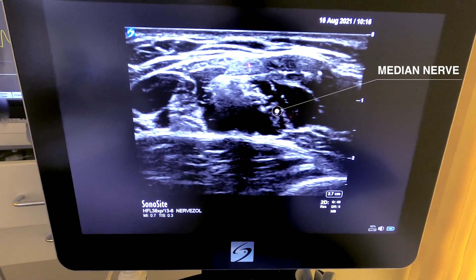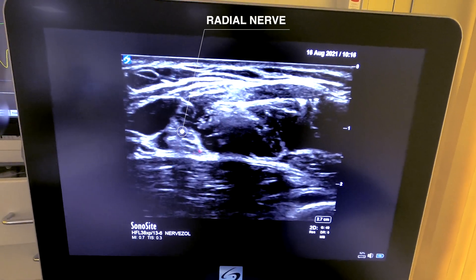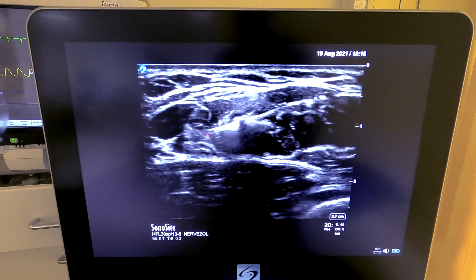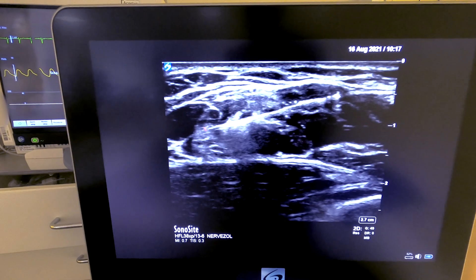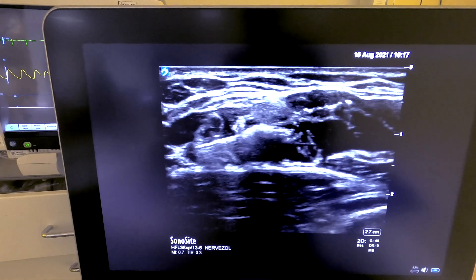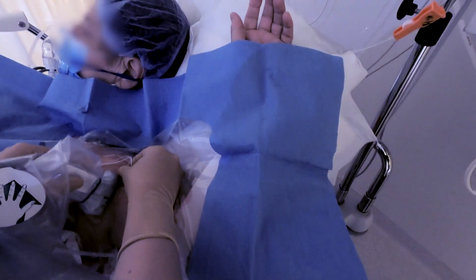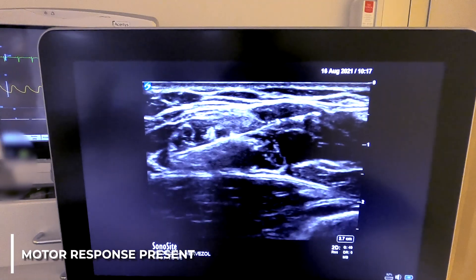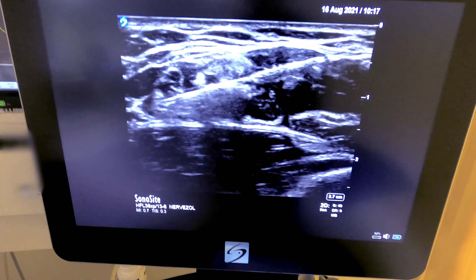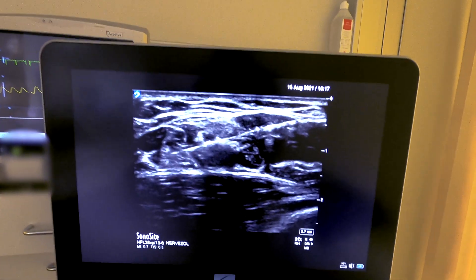The local anesthetic spread has blocked the median nerve and the ulnar nerve. However, we don't believe we have succeeded in blocking the radial nerve, so we direct the needle down and advance it towards the radial nerve. We get a motor twitch response, which allows us to pull the needle back — because without that twitch we wouldn't have known we were at the radial nerve. This is a good example of nerve stimulation being useful as a monitoring tool, not a nerve localization tool.